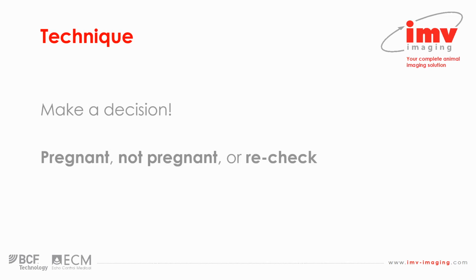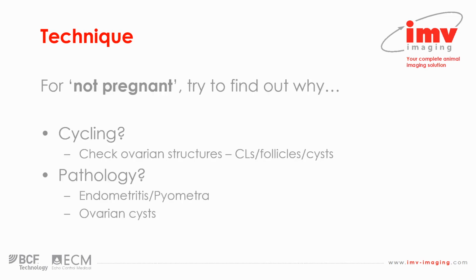And then the key when you're performing rectal ultrasonography is, once you've performed the exam, make a decision. The decision you make may well be, I don't know or I'm not sure whether this animal is pregnant or not, in which case make a note to recheck her. But that is your decision. It's a positive, firm decision. Obviously, if you're convinced she's not pregnant or she is pregnant, then that's fine. But you need to make one of those three consciously and positively, and make sure you do book her in for a recheck, or the farmer books her in for a recheck if you're unsure.